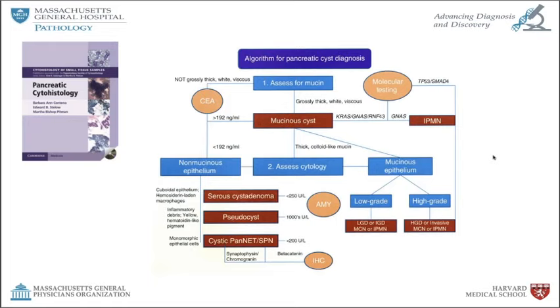And two, it would dilute and attenuate your background information that's critical, like the quality of the mucin and the necrosis. And then you're only getting a representative aliquot of the cells in your slide. A cytospin is going to spin down just about everything that's in that fluid and put it on the slide. So you're going to see many more cells. You're going to see the quality and quantity of the mucin.